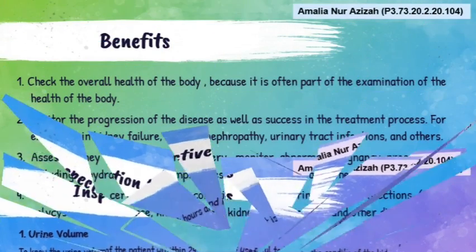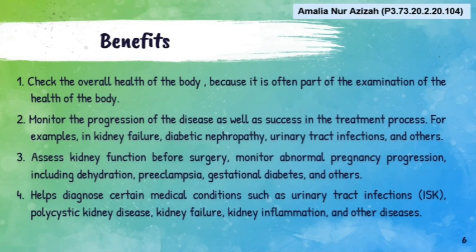Benefits. 1. Check the overall health of the body because it is often part of the examination of the health of the body. 2. Monitor the progression of the disease as well as success in the treatment process, for example, in kidney failure, diabetic nephropathy, urinary tract infection, and others. 3.